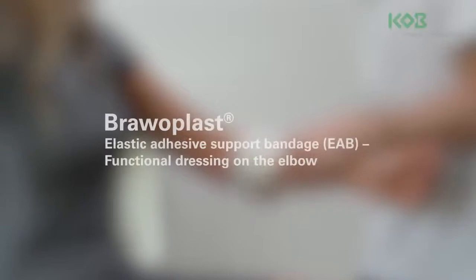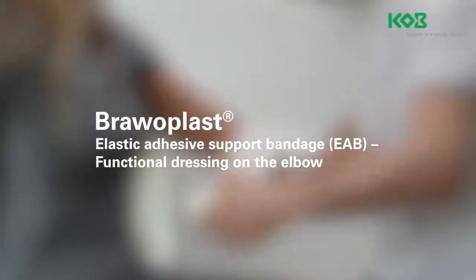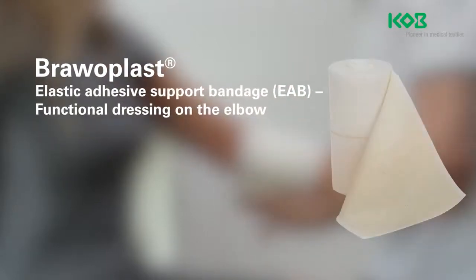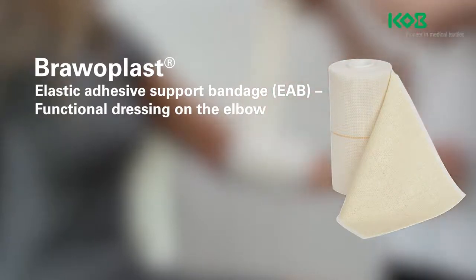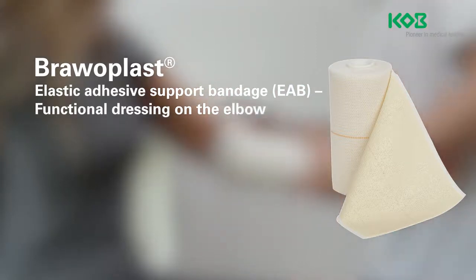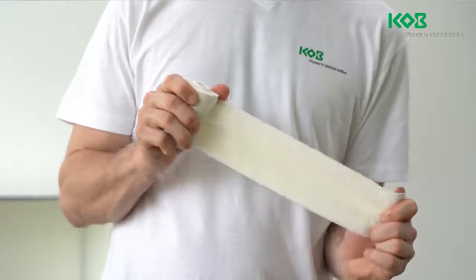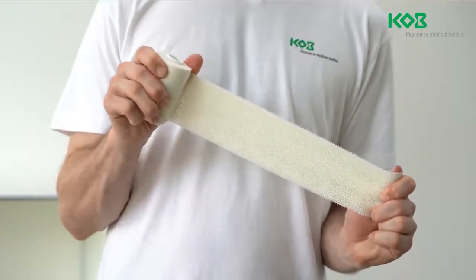The Brawoplast Elastic Adhesive Support Bandage, known as EAB for short, is made out of 100% cotton coated with an adhesive compound. This adheres the bandage directly to the skin, providing a secure hold for the dressing. Brawoplast can also be used as a support and relief dressing for injuries of the musculoskeletal system and for gentle compression after blunt injuries or for prevention.